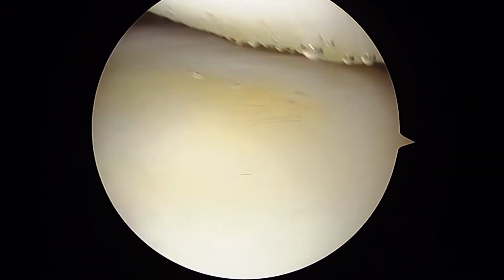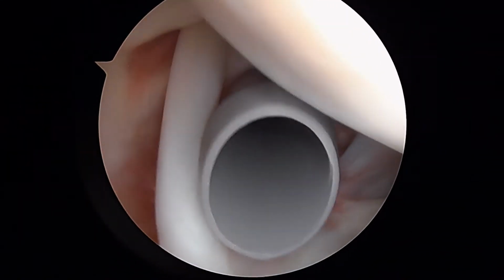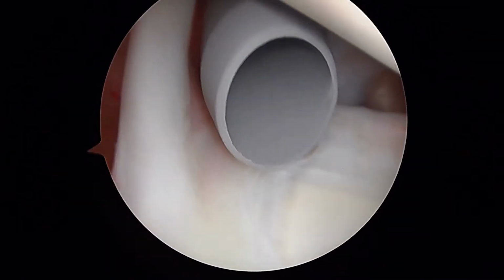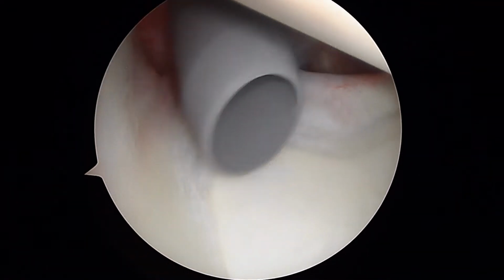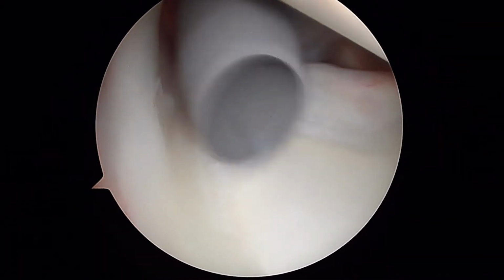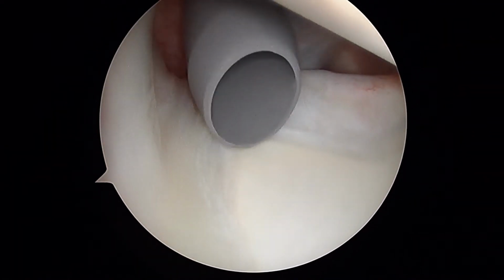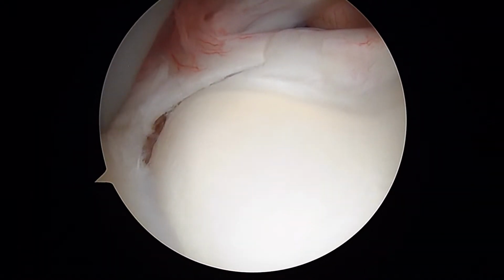And what we're seeing here, as we take our first walk through, is the biceps tendon. As we look down at the biceps anchor, this is the area we were worried about. And here you can see how loose this is. This is what we call a SLAP lesion. It's what the MRI scan showed. It's what your history and physical exam suggested. And we're going to take care of that for you today.